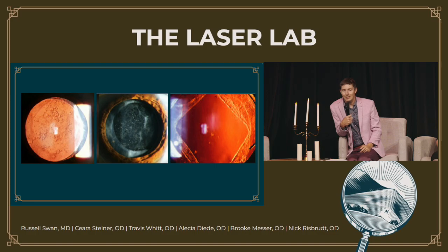So again, classic example, posterior capsule opacification, 2 examples on the left, kind of a classic diamond opening with a YAG afterwards. Now, I thought what would be fun would be just to run through some wildly unusual cases that don't often come up. I've seen all of these, and I think they're fun to be aware of, because they're the unicorns of posterior capsule opacification, or the unicorns of YAGs, and it's worth knowing about, because sometimes otherwise it's a little bit confusing.